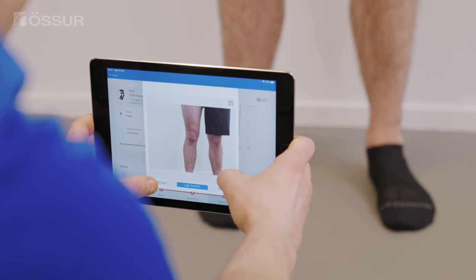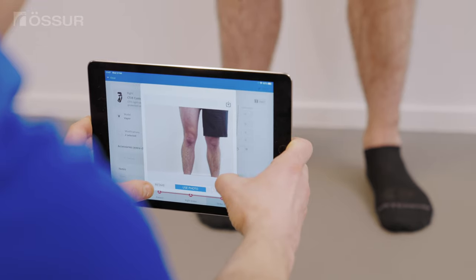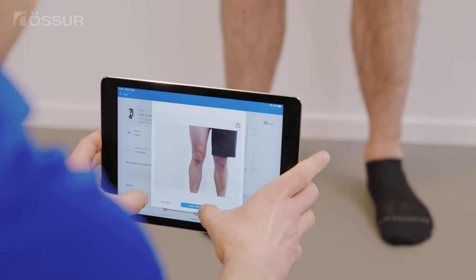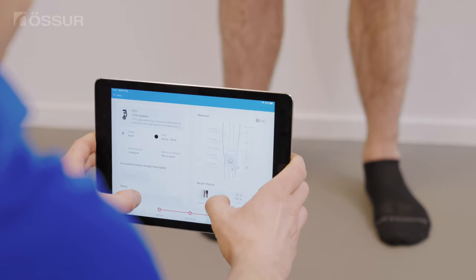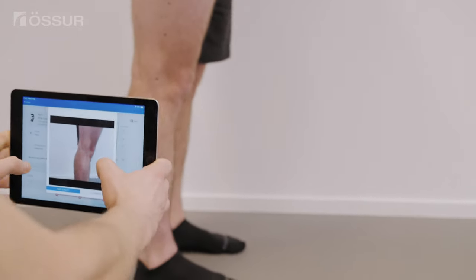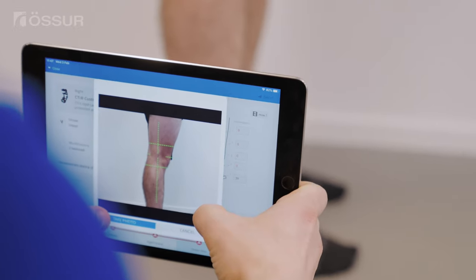When taking the anterior view, it may be necessary to move medially or laterally to capture an equal view of the medial and lateral contours or the line of progression. Turn the patient 90 degrees and capture the lateral view.